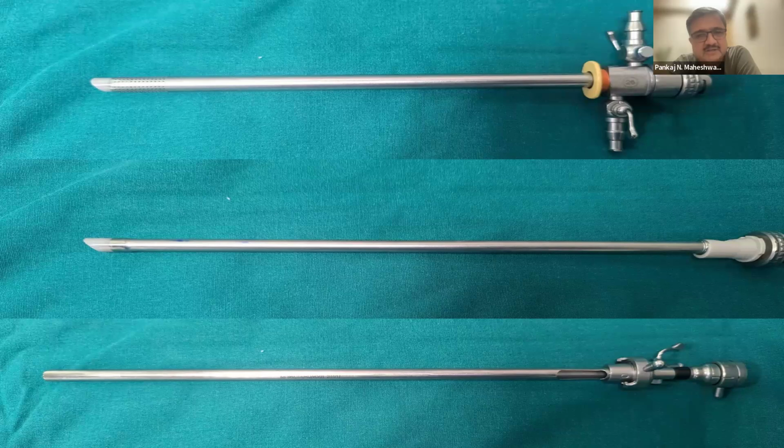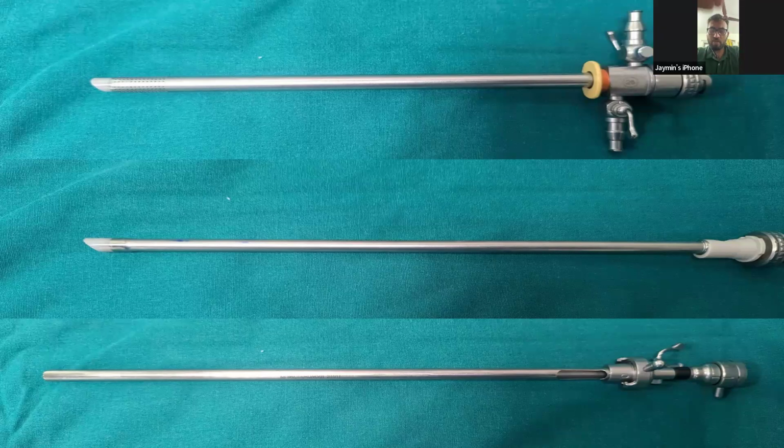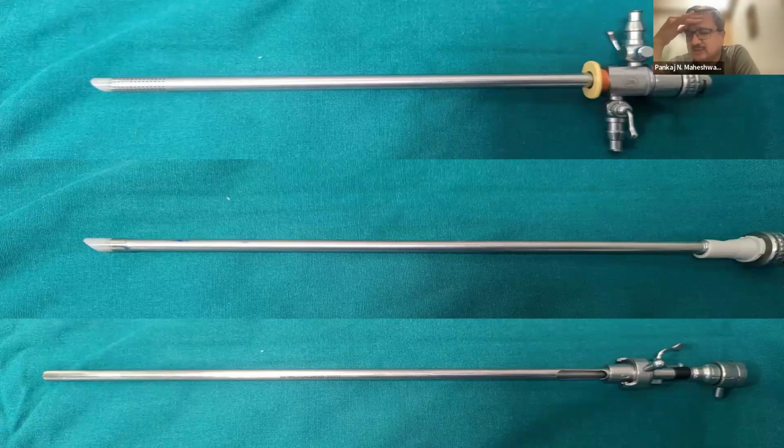So what is the advantage? The advantage is that we do not need to empty the bladder every now and then. It comes out on its own, so the bladder is not completely full. Plus, it helps in better vision. Because the fluid is returning on its own, and we do not need to empty it again every now and then, it is a continuous irrigation. What you have said is correct, but it is still not the most important reason.